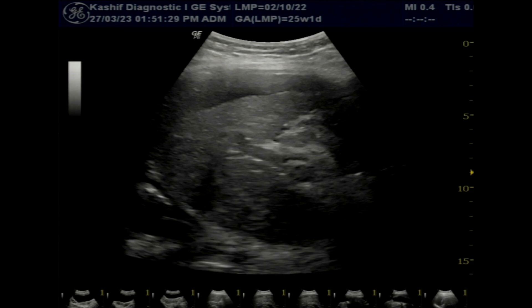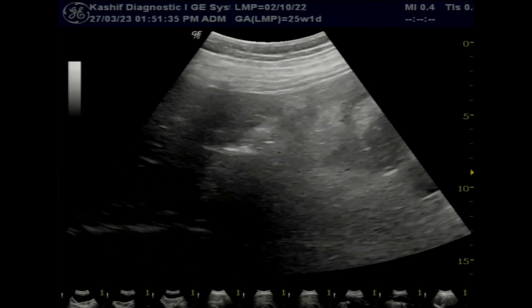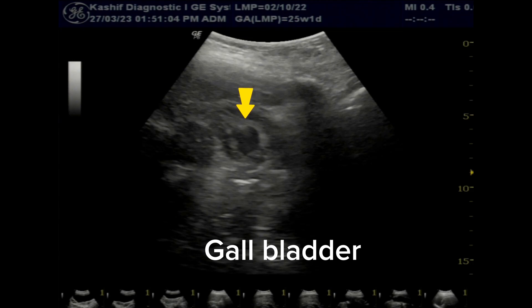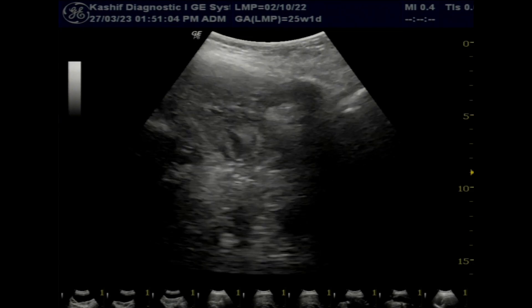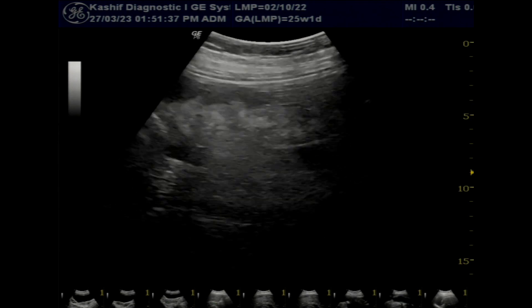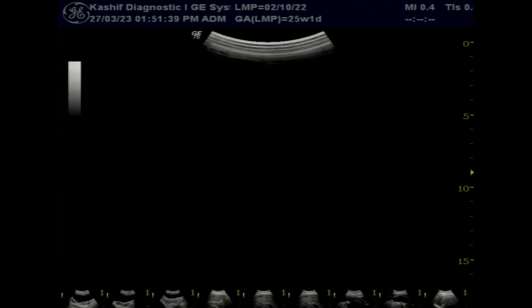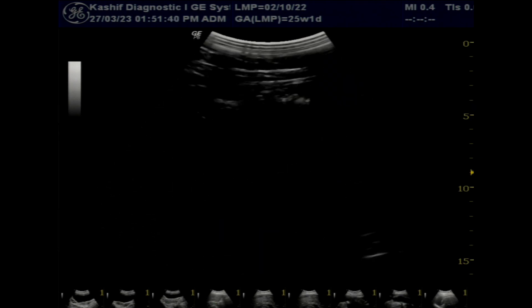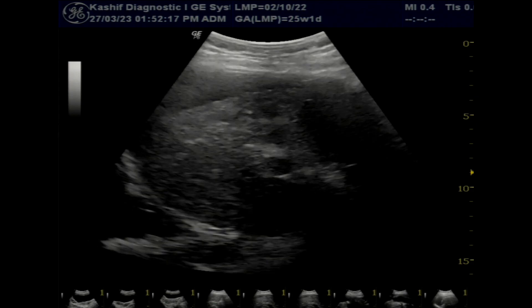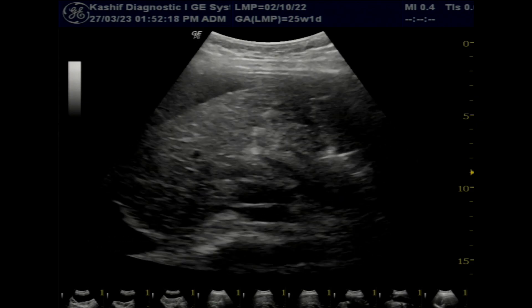The gallbladder is visualized — this is a thick-walled, 10 millimeter, contracted gallbladder. Wall thickening in this case is due to chronic liver disease and ascites. The liver is asymmetrical; size is decreased at 13.1 centimeters, with coarsening of texture and moderate to marked surface irregularity.